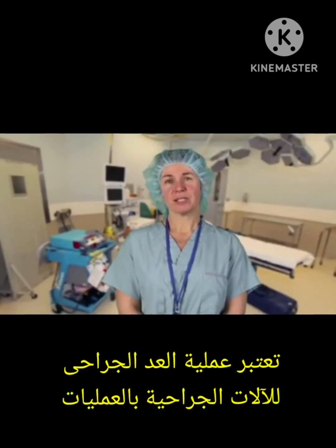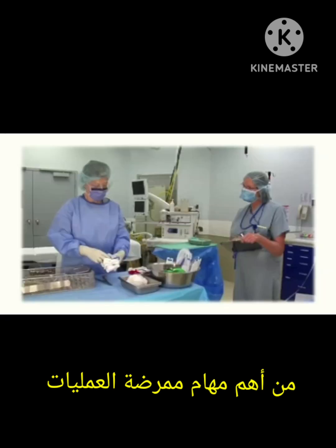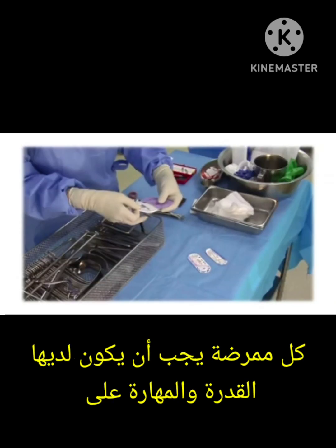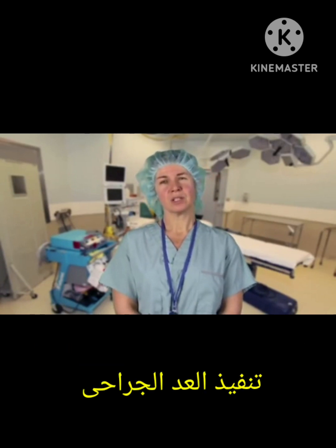Each perioperative nursing patient is entitled to competent, safe, and ethical care. The count procedure is an important enactment of patient caring and surgical conscience. You will have the opportunity to perform this skill during surgical procedures beginning in a lab setting. We are confident that you will soon develop the skills and knowledge associated with the surgical count that your patients depend on you to provide.